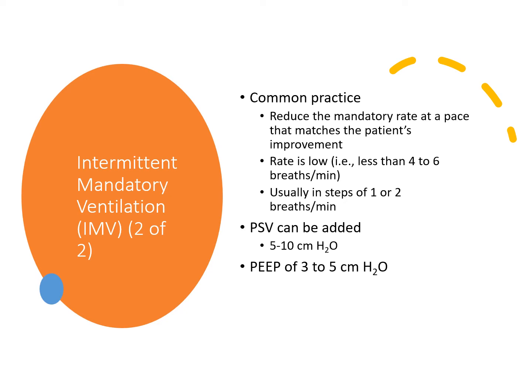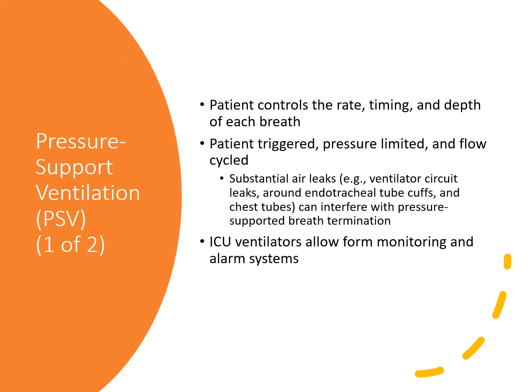So usually their spontaneous respiratory rate might increase if they're not ready to be extubated. If you start to see that spontaneous rate or that triggering rate go over 35, that may be a sign they're not doing well with that low level of support. All right, so that was SIMV.